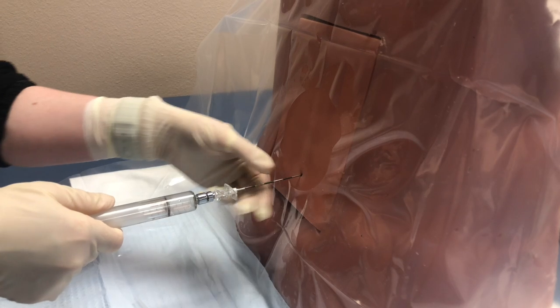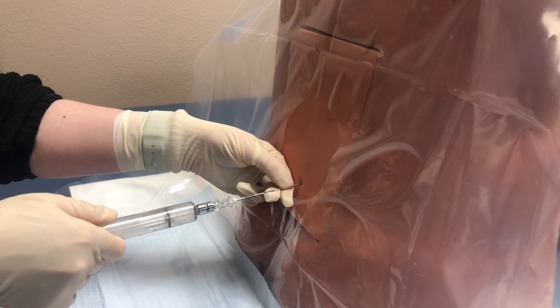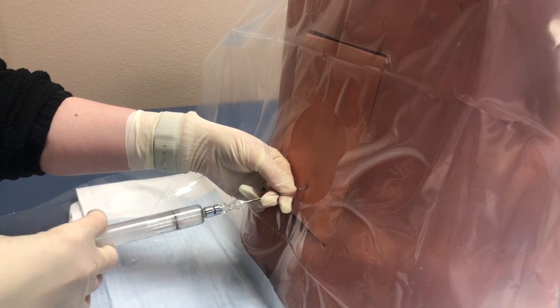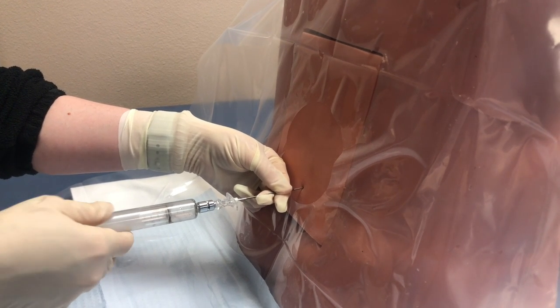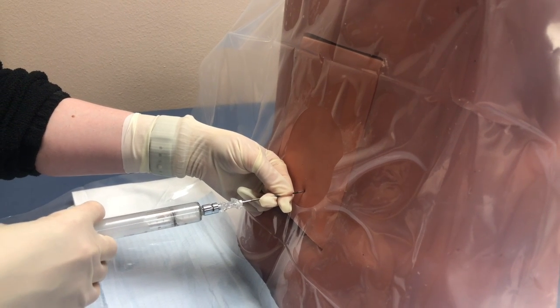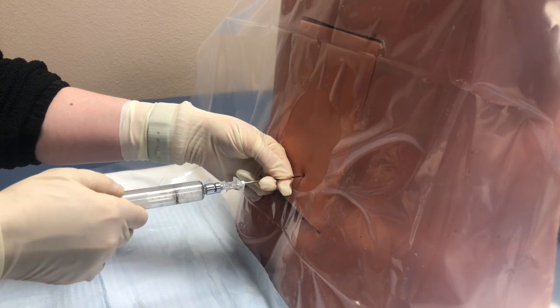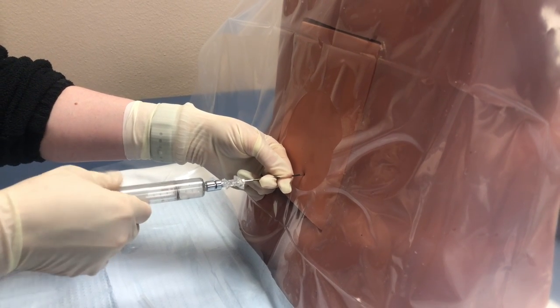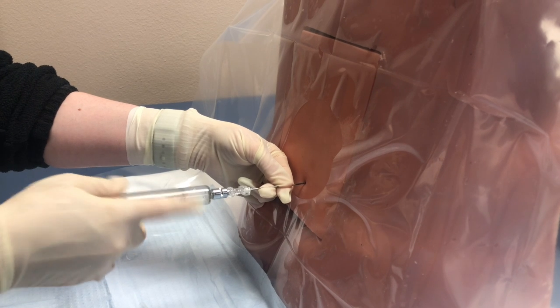After the stylet is removed, the needle is slowly advanced using the loss of resistance technique. A loss of resistance syringe containing 2 to 3 milliliters of normal saline or air with a freely movable plunger is securely attached to the needle. If the needle is in the ligament, it should not be easy to inject saline or air, and there should be some resistance felt when slight pressure on the syringe plunger is applied.